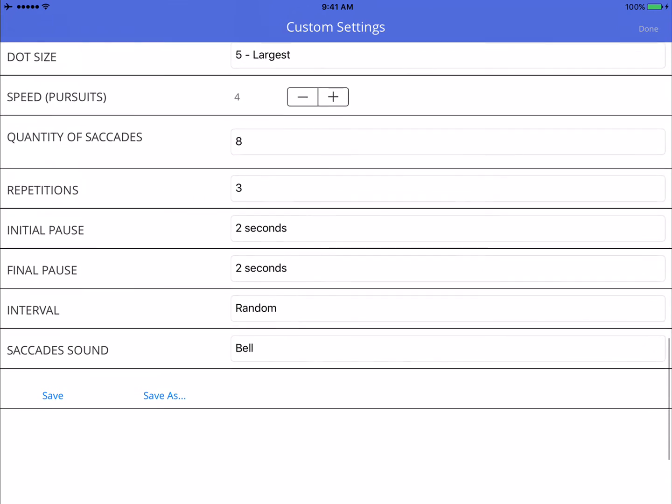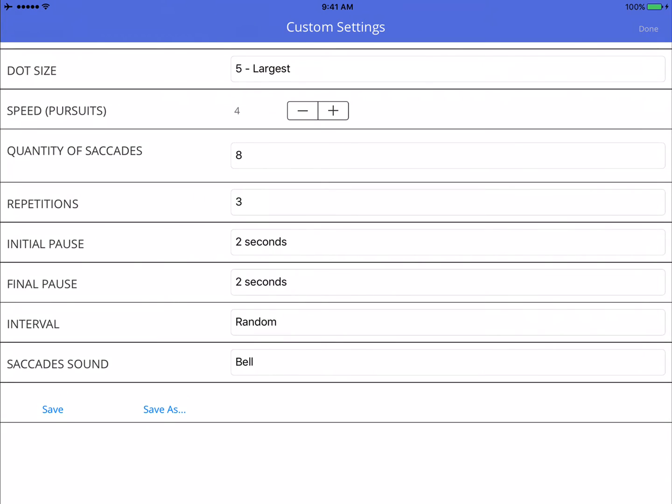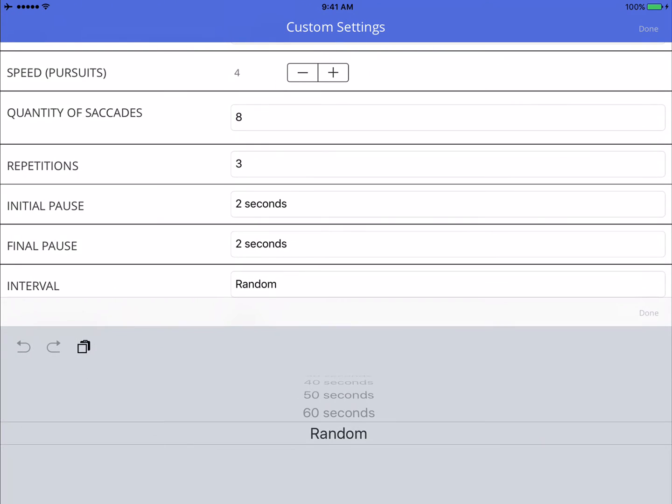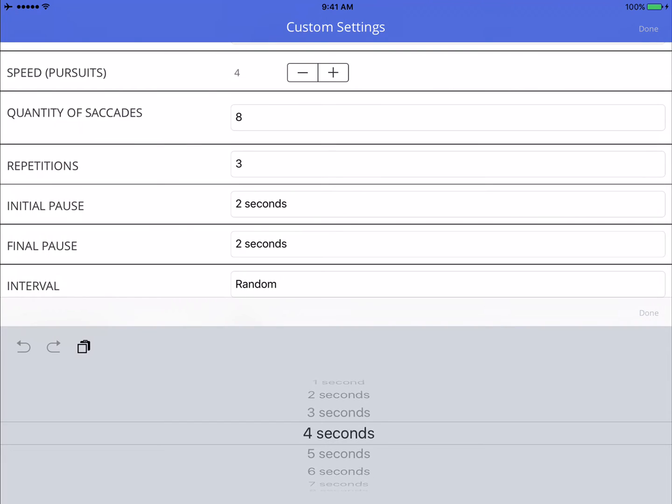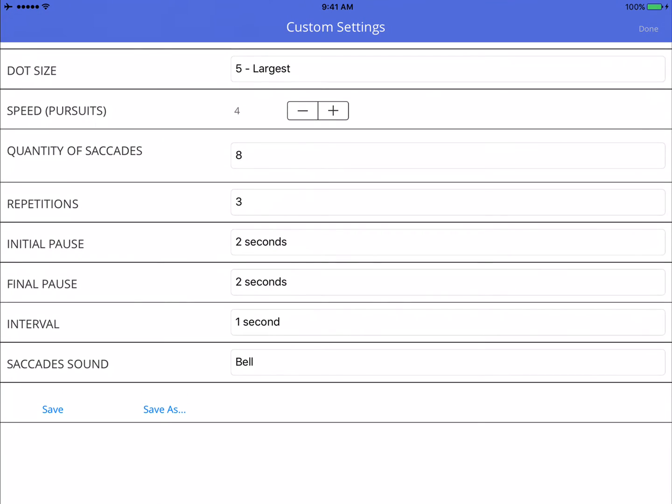Final pause, two seconds. Intervals are going to be random, and so that way he can't anticipate. And in this case, I may actually, a good option would be to make it every one second, so that way it would be easier. So when it's difficult to generate saccades, we want to do everything we can to help him do them well. So at one second interval here would be a really good option.